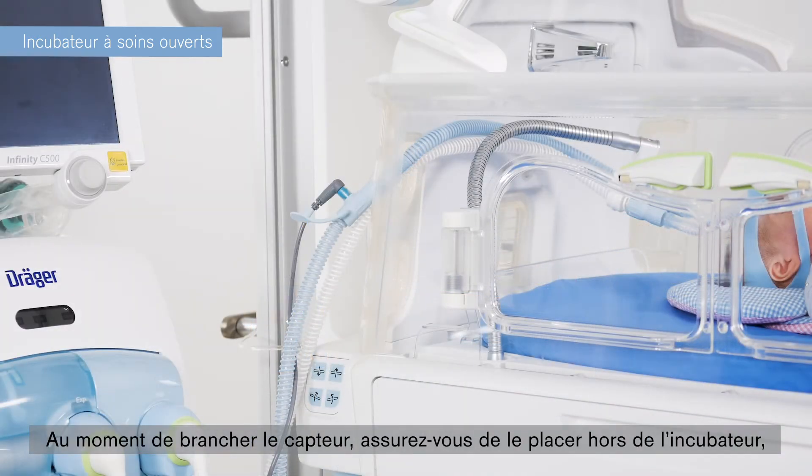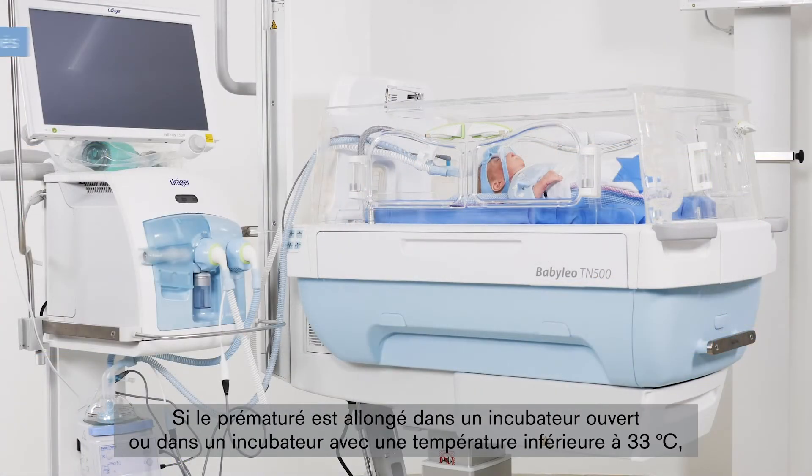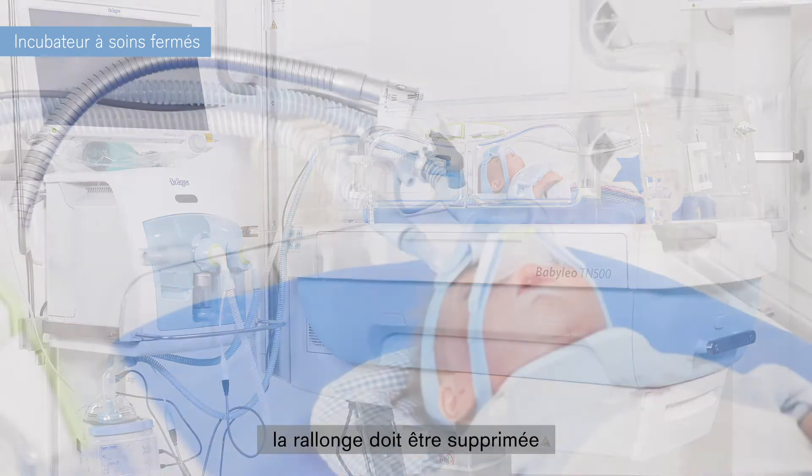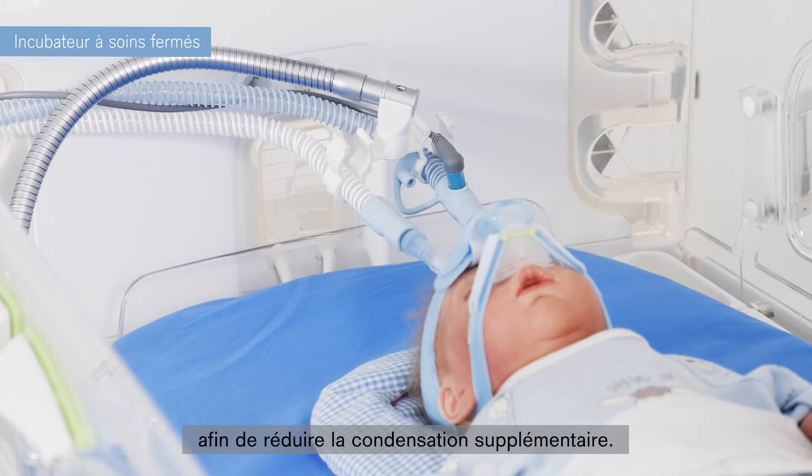When positioning the sensor, make sure that it is placed outside the incubator. Otherwise, an incorrect measurement due to thermal interference may lead to a reduction in humidification. If the premature infant is lying in an open care unit or in an incubator with a temperature lower than 33 degrees Celsius, the incubator extension should be removed. This reduces additional condensation.